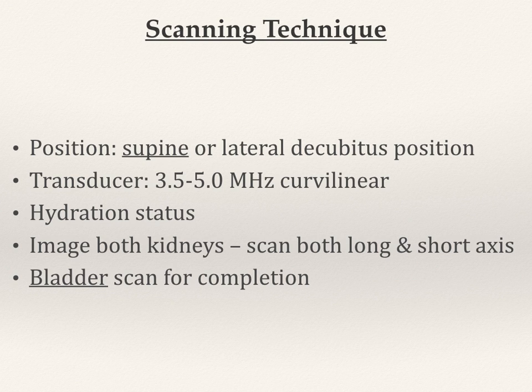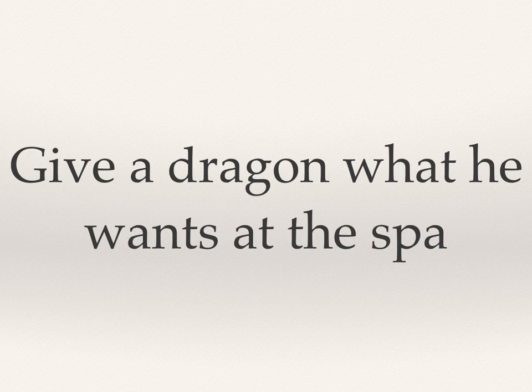If I've got a rib away that's just being a pain and then I need to rotate 90 degrees, sometimes I will. Now, this will be the first thing that'll get me in trouble. If we're looking at how we need to have the probe itself oriented, I made up this story just about a dragon that goes to a spa. So if you'll bear with me for this one.